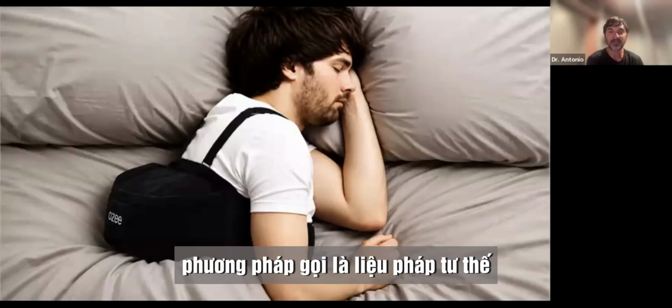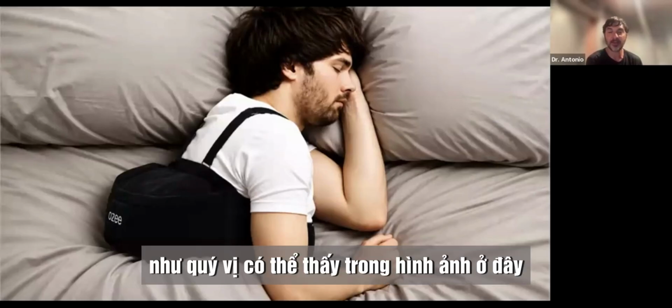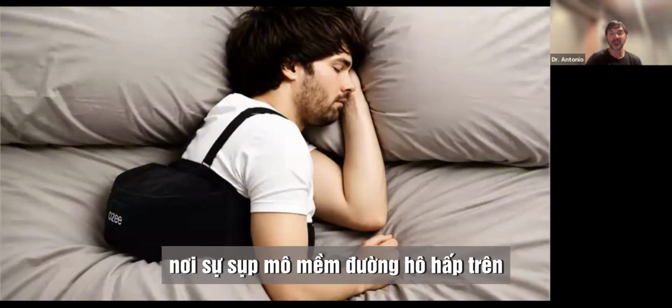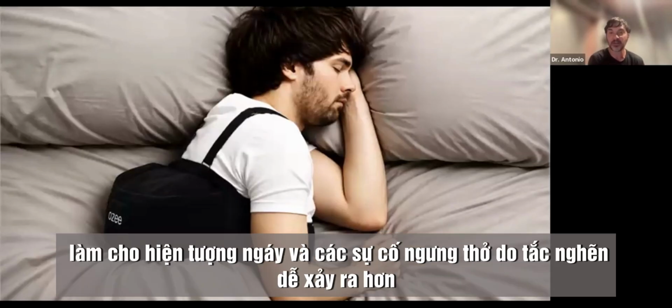Positional therapy belts, as you can see in this image here, are designed to prevent patients from sleeping in supine position, where upper airway soft tissue collapse makes snoring and obstructive apneas more likely.